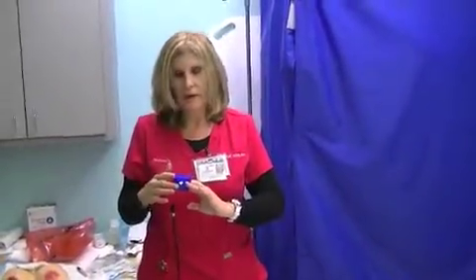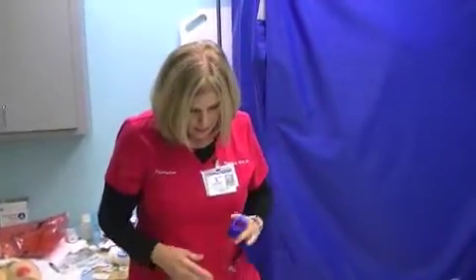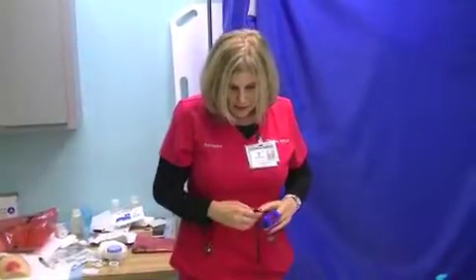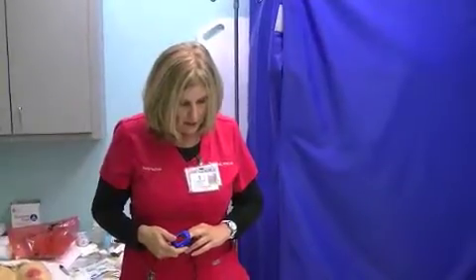The other thing is we never want to use the pulse that's on here, because if we use the pulse that's actually reading on here, a lot of times these are inaccurate. You should always take a manual pulse when you're doing the oximeter. We also want to make sure that we obtain the reading. If we have somebody that has some irregular respirations, we definitely want to take a pulse oximetry.